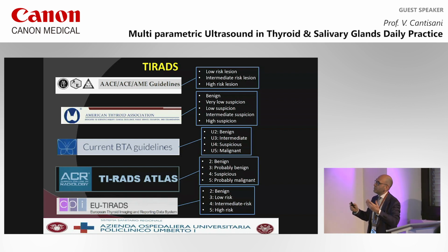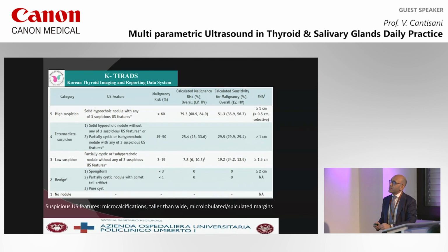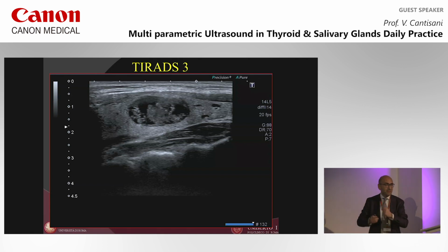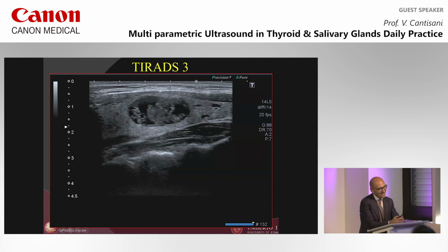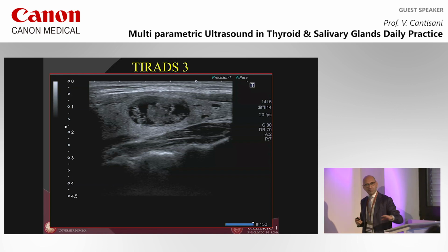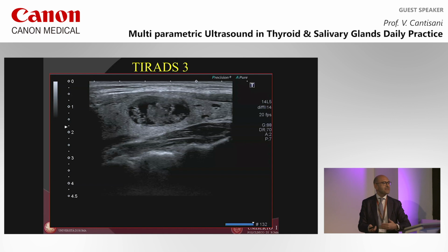They describe from 3 to 5 classes of risk, the K-TIRADS. And then if we review some cases together, it would be interesting to understand how you classify them. For instance, this one, according to ACR, is 3, a mixed lesion. How do you rate? Follow-up. So benign. And there is another thing. What is the history of the patient? Okay, it's true, yes, of course, it is firstly based on lab analysis. Follow-up. Okay, so benign, still benign.